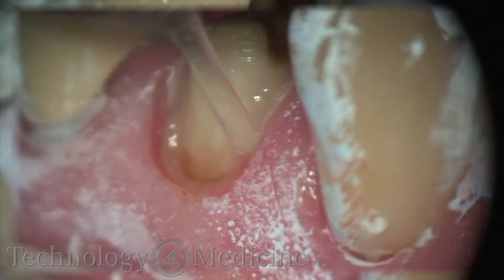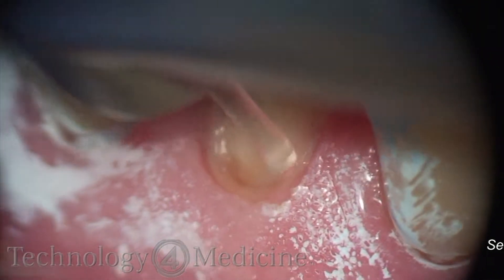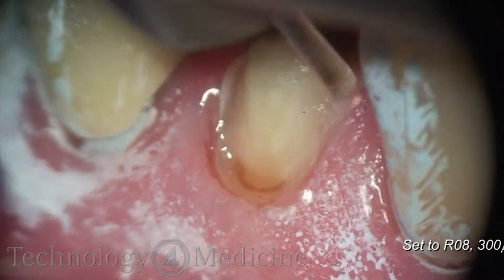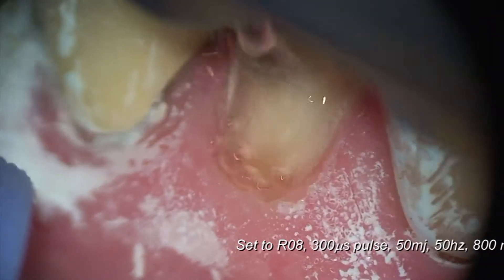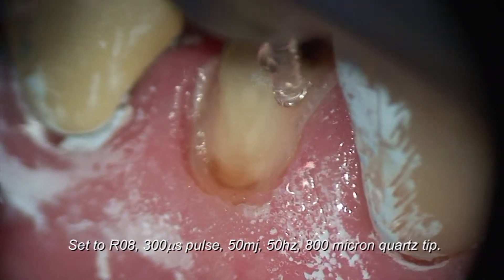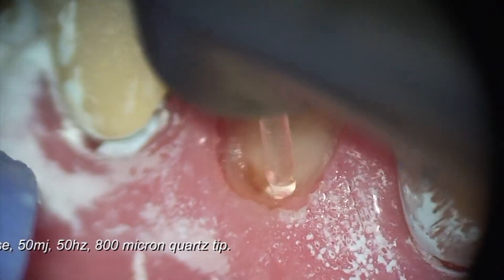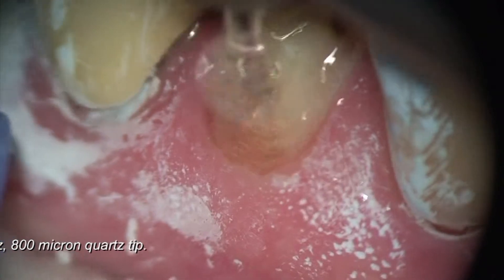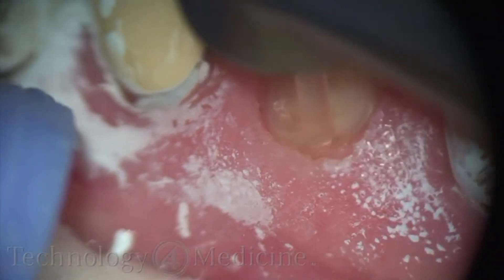I'm going to find some fault in the preparation here. You have a couple of choices — one can pull out a diamond and smooth, or in this case, I decided I would just use the laser. Setting the laser at a very high hertz, or repetition rate, I'm able to smooth the margin very easily and efficiently without having to put a handpiece in. Patients like the fact that I use the laser instead of the drill in this case.